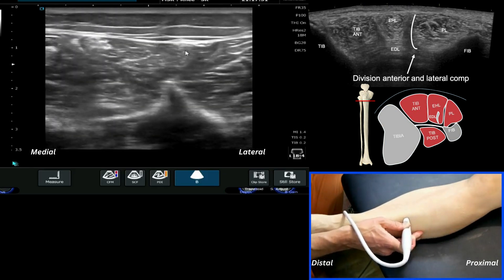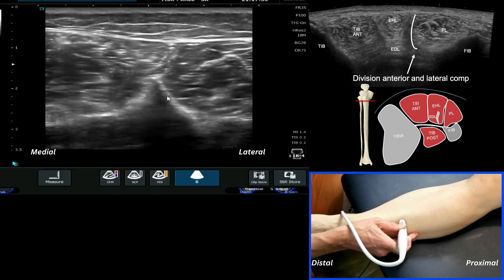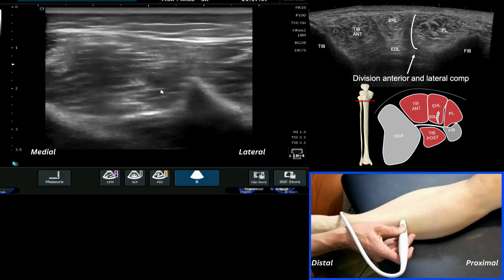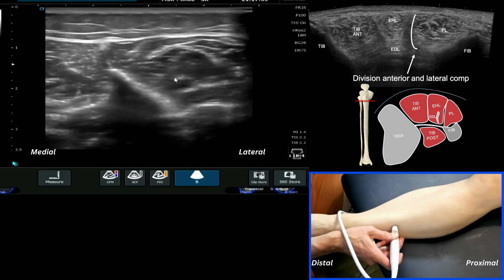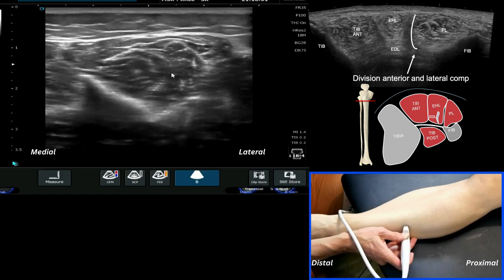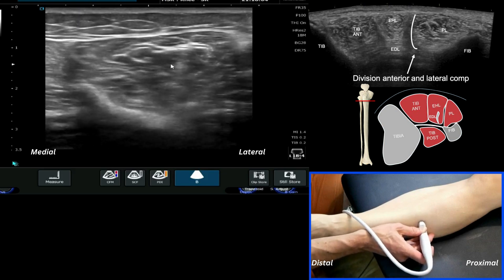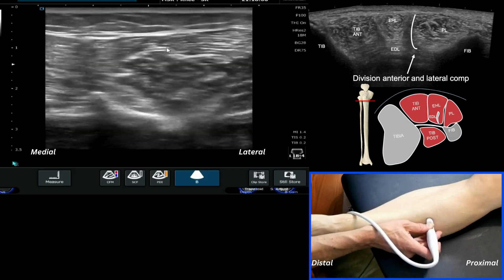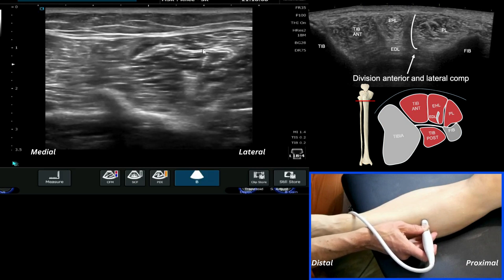Coming a little further around, we can see another distinct skeletal landmark — the fibula. Transitioning around from that, we're back into familiar territory with the lateral compartment, and at this point of the lateral lower leg we can see the formation of the peroneus longus muscle.